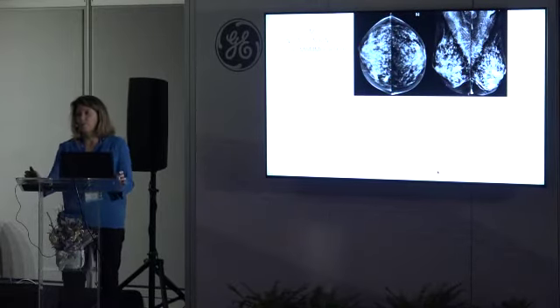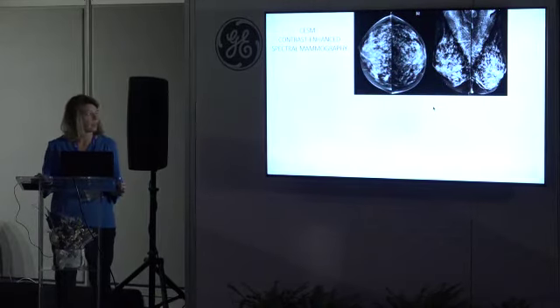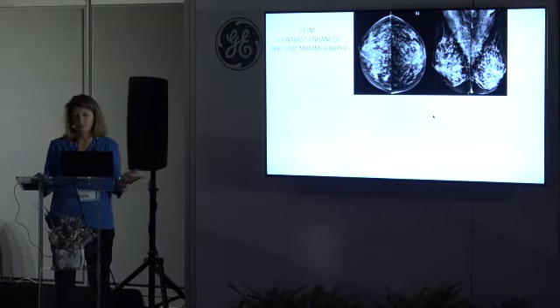You probably know a little bit about contrast mammography, but with these small examples, you will see the main interest of contrast mammography. This is a difficult mammography with a dense heterogeneous breast. This patient was recalled after screening for a suspicious lesion on the right breast, and she also has pain on the left, but it is very difficult to see. On ultrasound, there was nothing on the right. Finally, she was included in our protocol where we are evaluating contrast mammography.